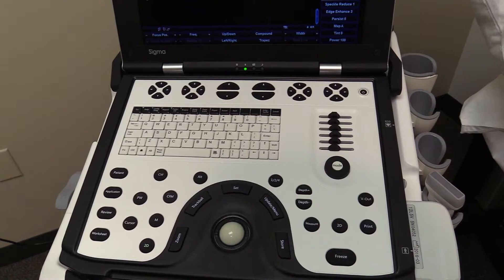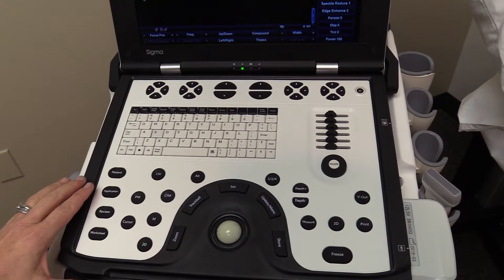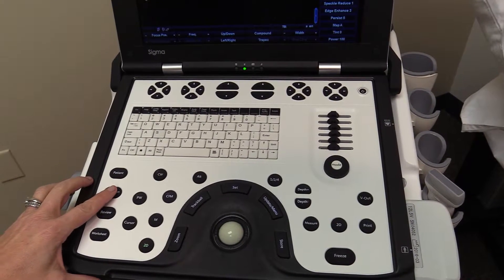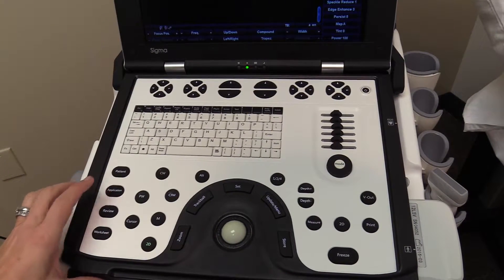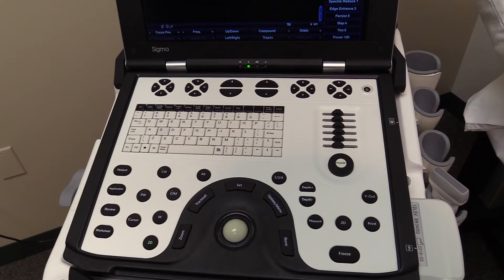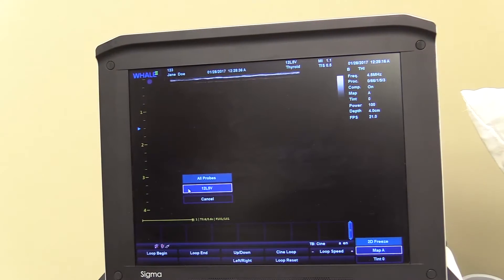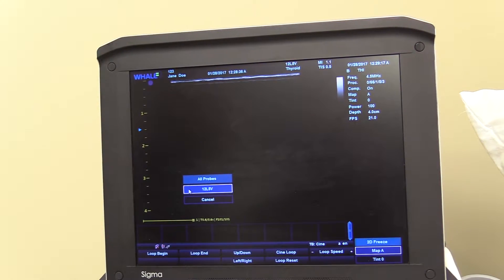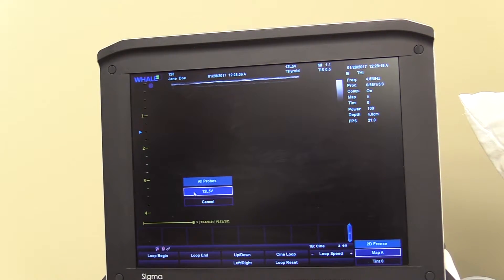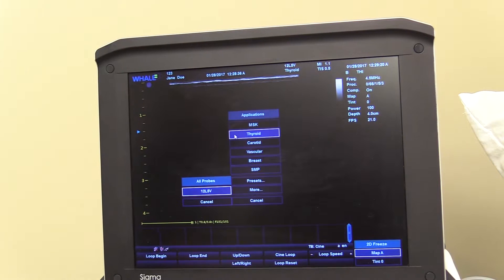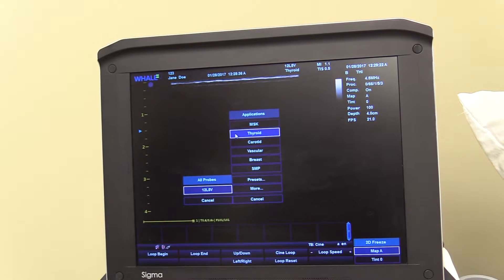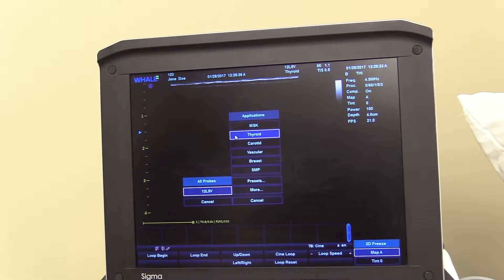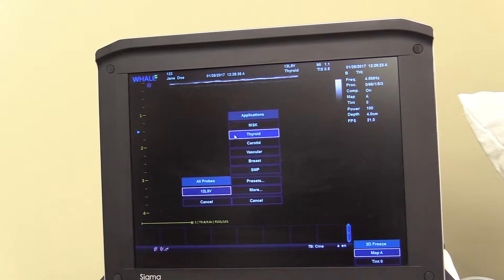Select the application and probe. Click the application button to display the probe and application window. This will allow you to choose a probe and application for the current exam by selecting the appropriate exam type.